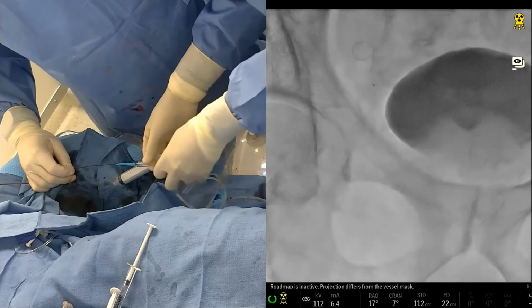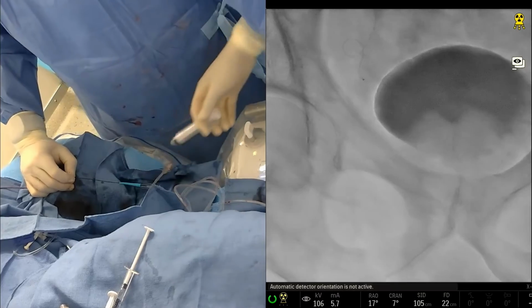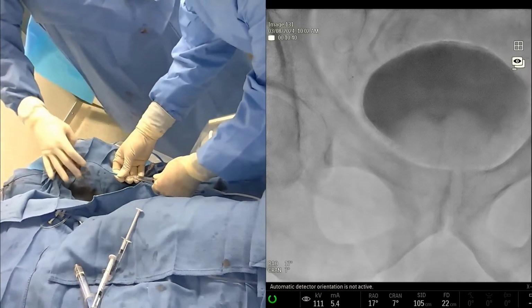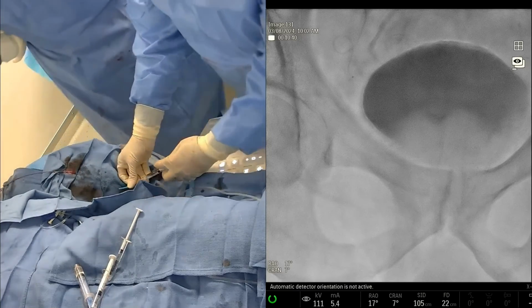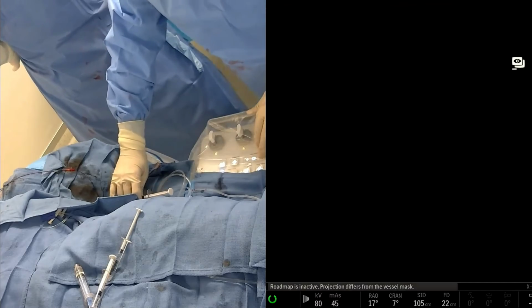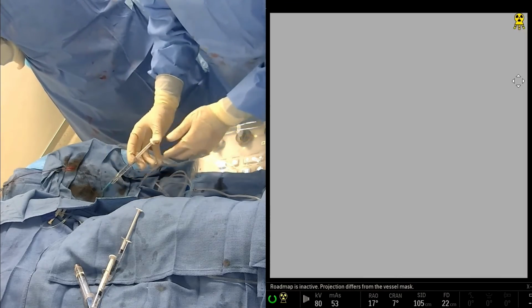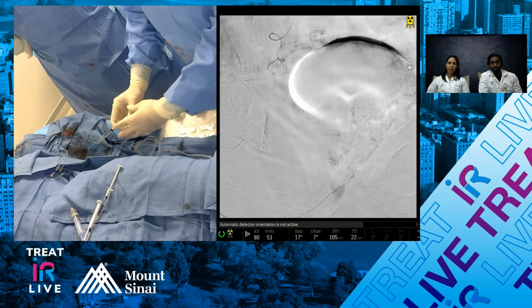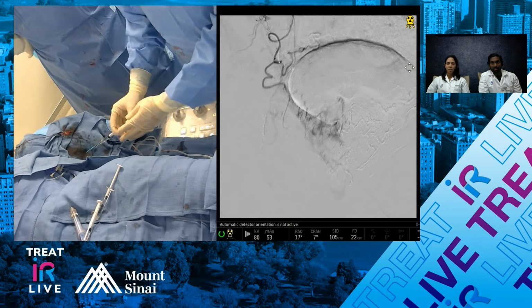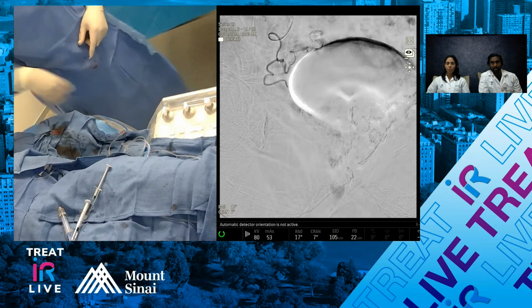But you guys will see in a few minutes, there's a big difference in how you inject an end-hole catheter with glue than a balloon tip catheter. And so we're much less deep oblique here. We're going to do a run, then we're going to do nitro. You good? I was going to mag out a little bit. I like it. When you're not using balloon occlusion, do you try to get the base catheter even closer to sort of provide a little bit of occlusive injection? Interesting. Yeah. Let's keep going. Further. We could do a little nitro first.